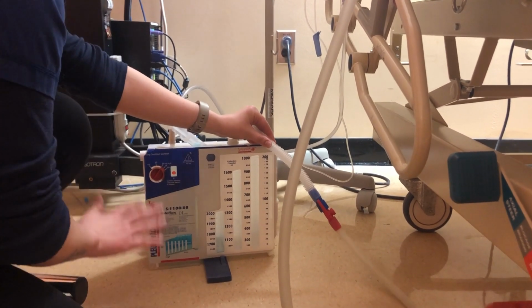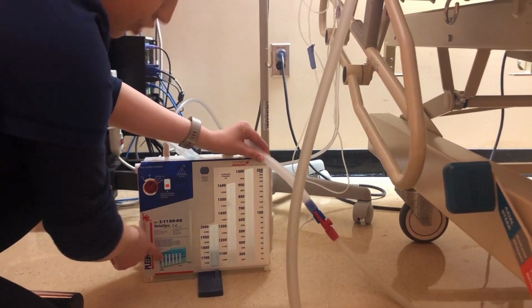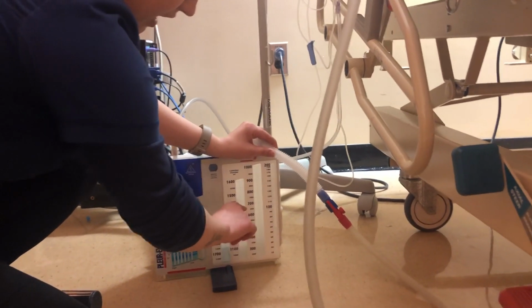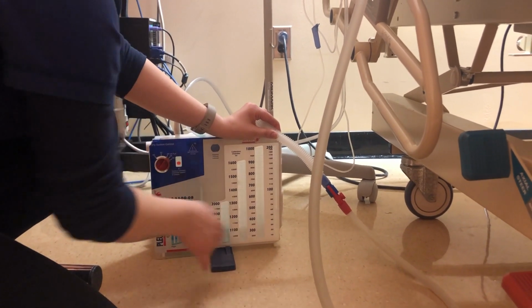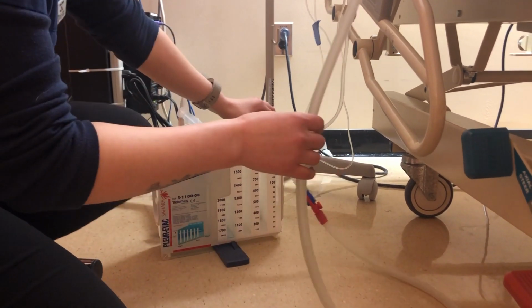I'm looking for tidaling, so it should be tidaling in and out with the patient's breath. Jacuzzi bubbles indicate an air leak, so we can check where that is coming from. I'm also going to mark where the drainage is at the start of my shift so that I can monitor its output. I'm also looking to make sure the drainage is pretty normal, so I don't want to see any frank red blood or purulent drainage.